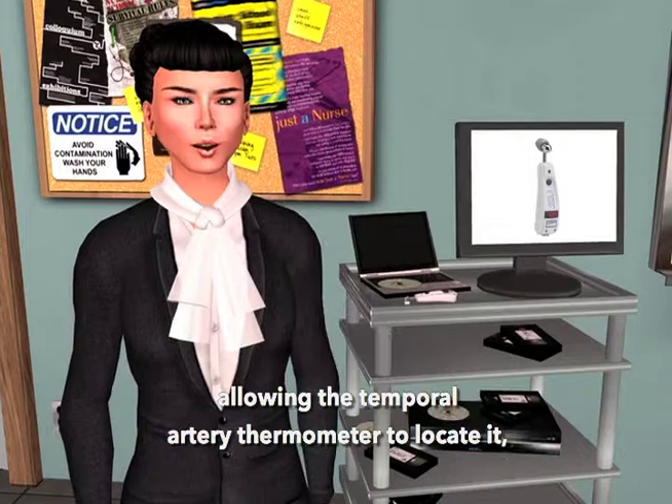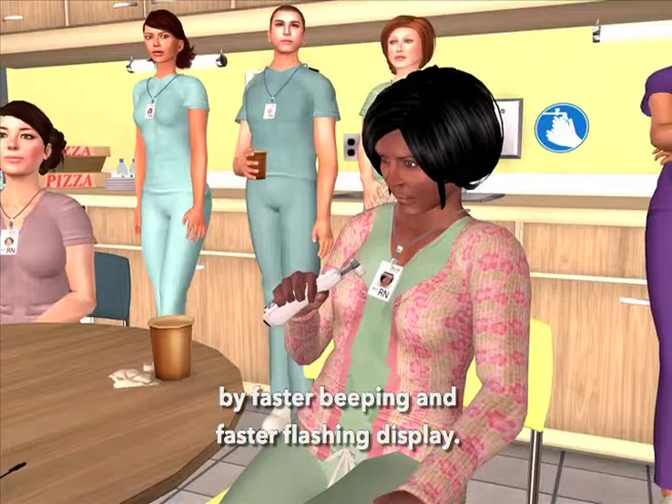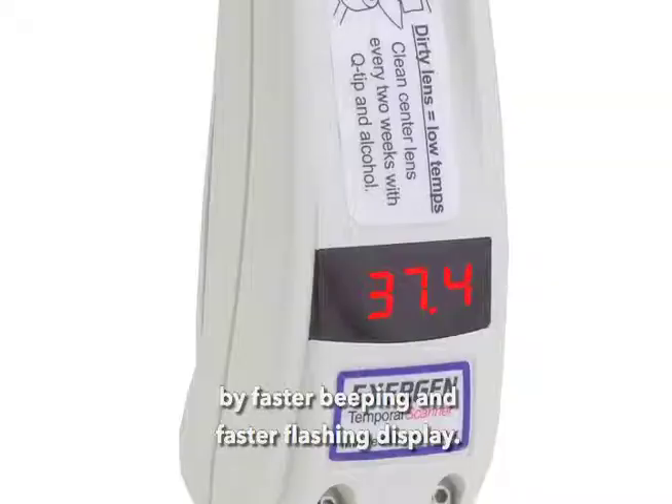The temporal scanner will indicate that you're scanning over the artery by faster beeping and faster flashing display. After you pass the artery, the beeping and the display slow down.